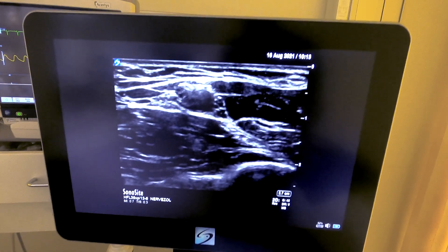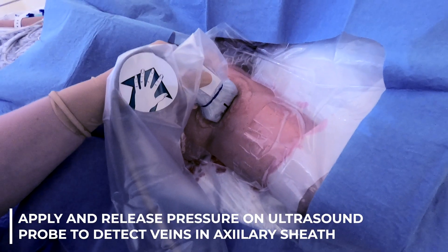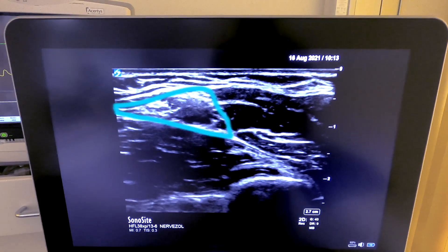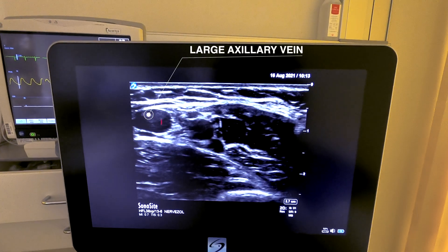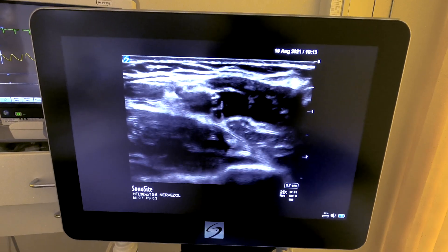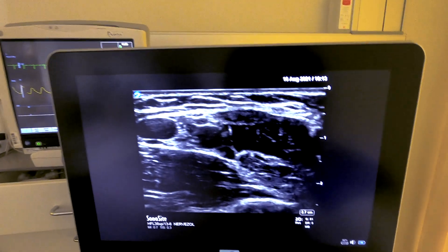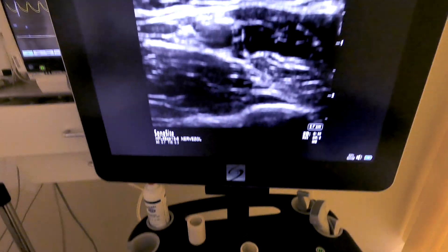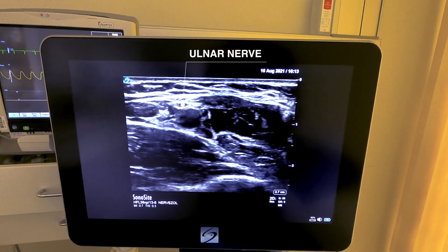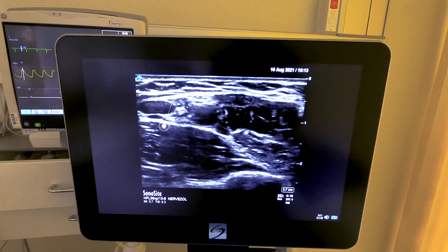We're going to do a couple of maneuvers — pressing and depressing on the ultrasound probe — which will help us determine the presence of vessels that we need to be concerned about. What we see is a very large axillary vein, the axillary artery as the main internal landmark, and underneath the axillary artery a couple of veins above and below the artery. Tweaking up the gain, we can now see the median nerve attached to the artery, the ulnar nerve above the artery, and the radial nerve underneath the artery sitting right on the conjoined tendon.